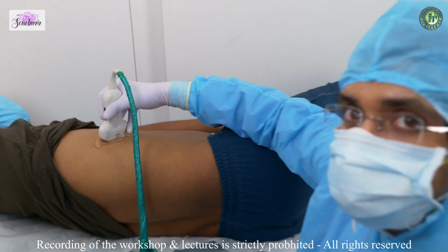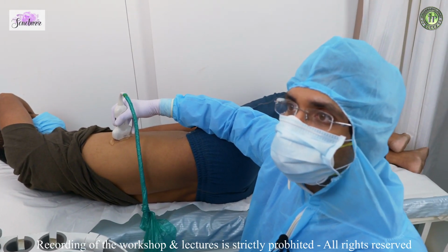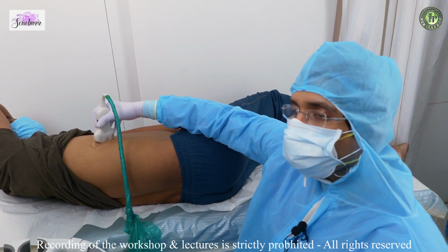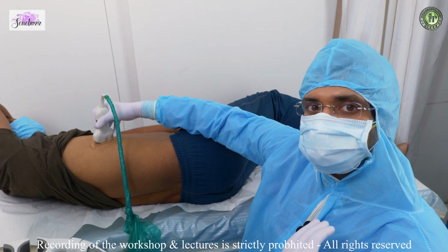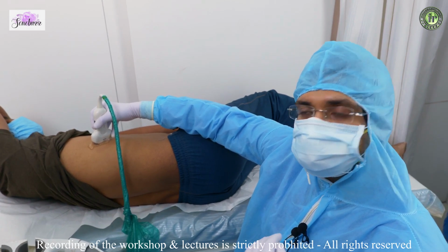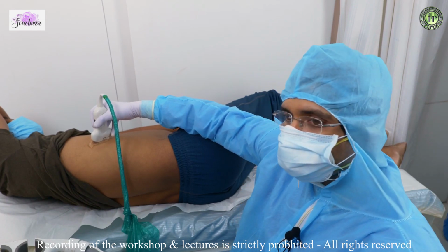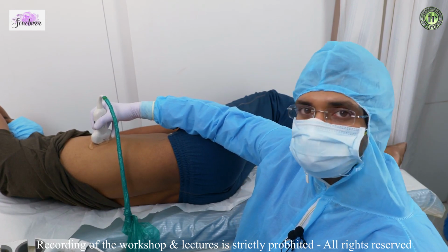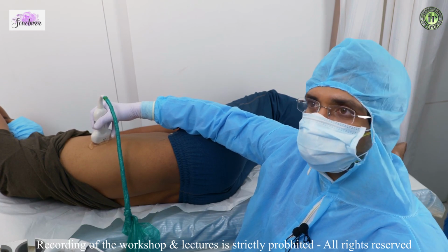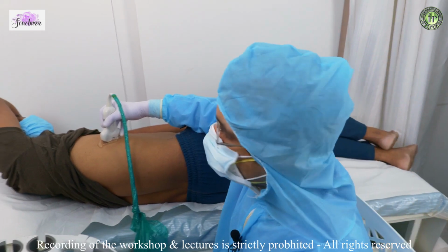The other important thing is how we ask the patient to breathe, or rather how we ask the patient to stop breathing. So we do not want the patient to take a deep inspiratory or an expiratory breath hold. We want them to have a mid-inspiratory breath hold. So it's a very good idea that you explain to the patient before you start doing the study how you want the patient to breath hold. So this is what we normally explain them.